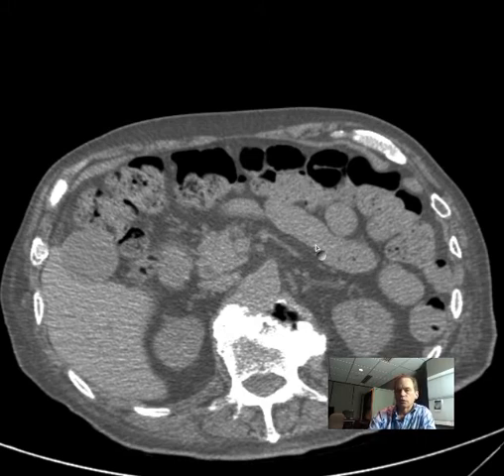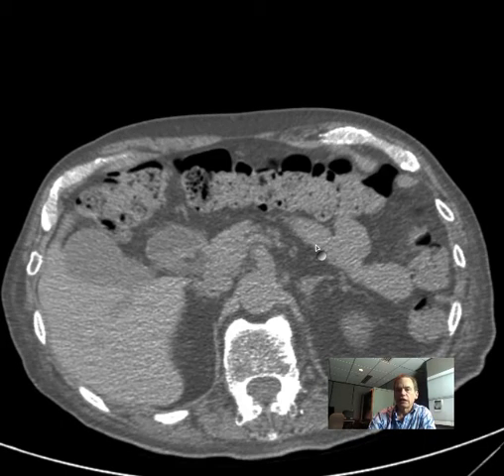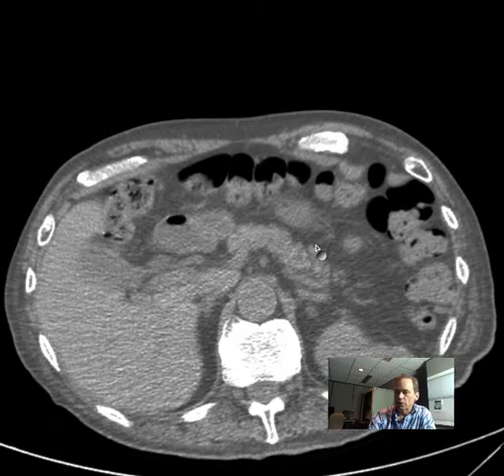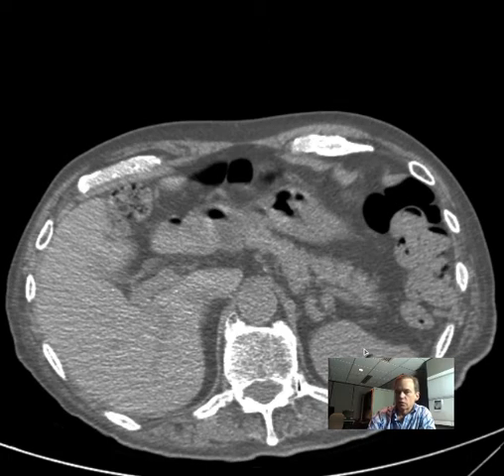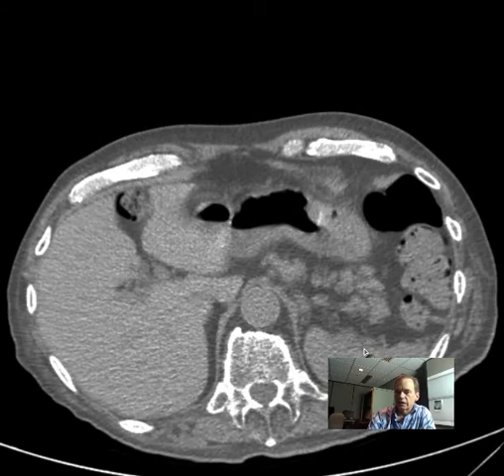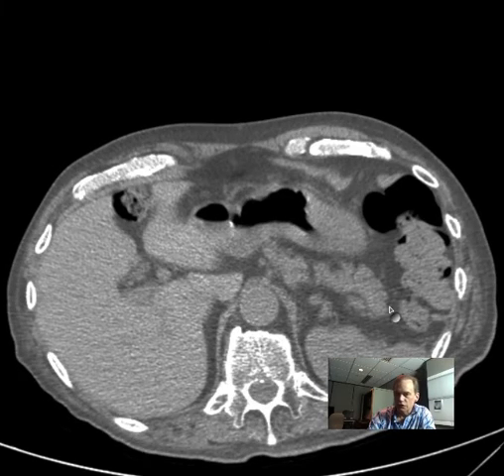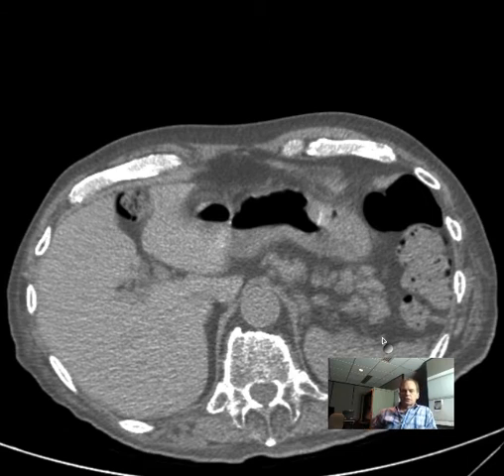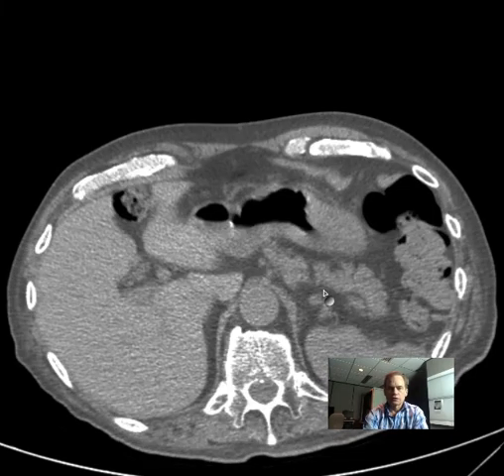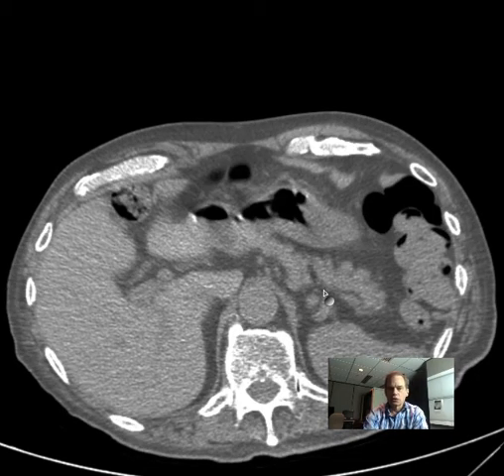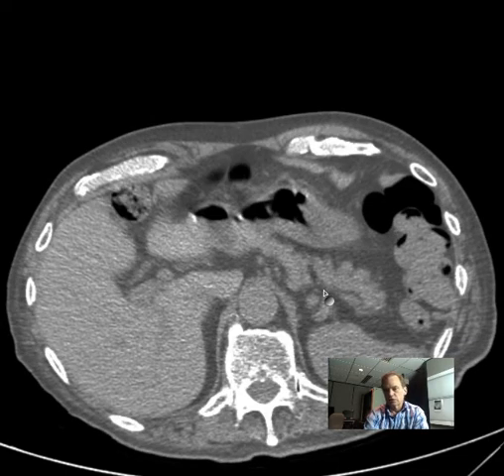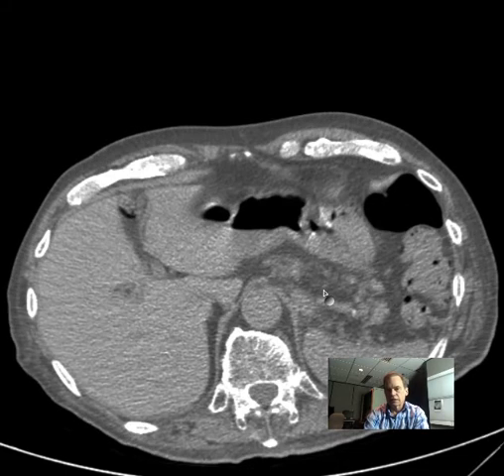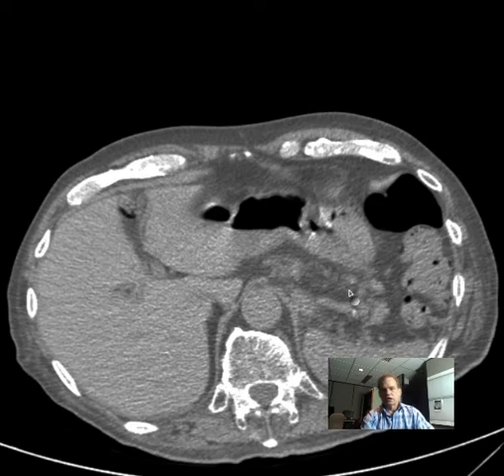Toward what will the tail of the pancreas be pointing? It always points to the spleen — it curves and points to the hilum of the spleen. This is because the splenic vein is always immediately posterior to the pancreas, so wherever the splenic vein is going, the tail of the pancreas is heading in that same direction.